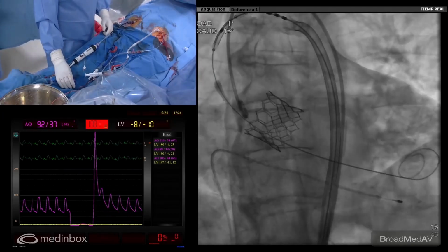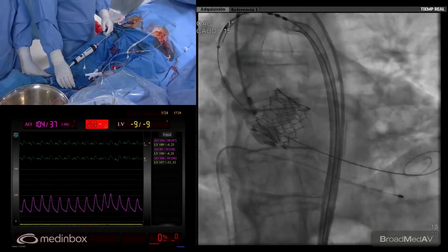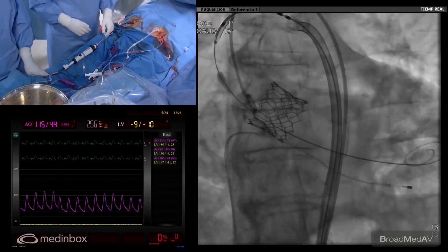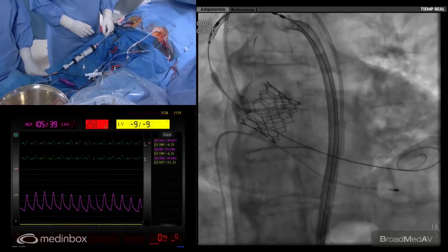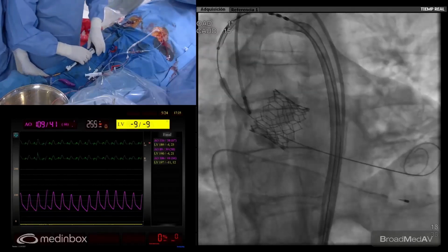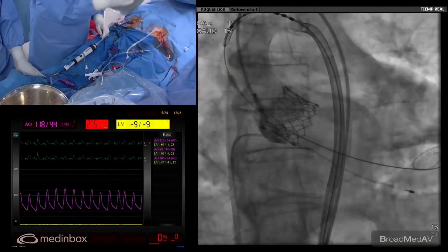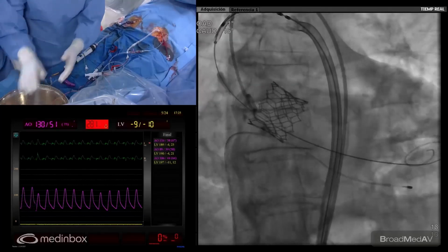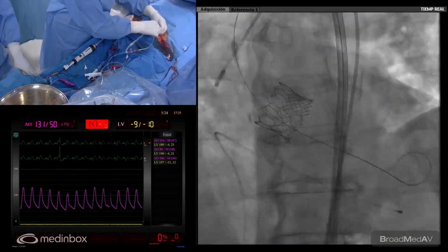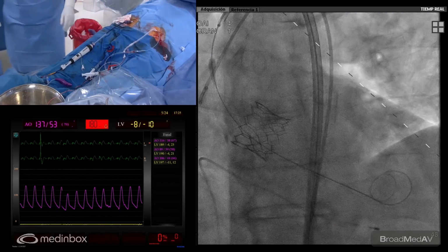So I think the position is okay. It's almost perfect because on the non-coronary cusp it is probably at 3 and probably 4, 5 on the left. Diastolic is now, well, the patient is still hypotensive, but I think we don't have to post-dilate anymore. Put AP view, AP. Okay. Dr. Murcastel is going to check because if we have a good outcome, I don't like to overstimulate this patient again.